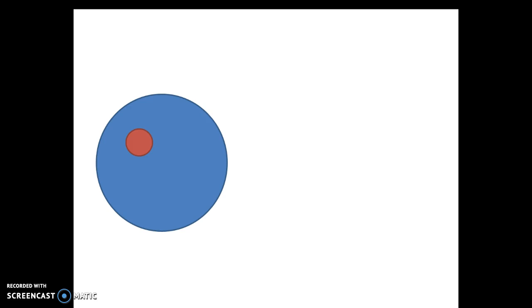Directions for this assignment: you are to complete or create 12 attenuation profiles of the object shown on your screen and lay them on top of each other in the 12 o'clock positions. Students will use the image provided on their PowerPoint file located in the Assignments tab on Blackboard. Once you have completed the attenuation profiles, you will then open the back projection document on Blackboard and complete your reflection questions.